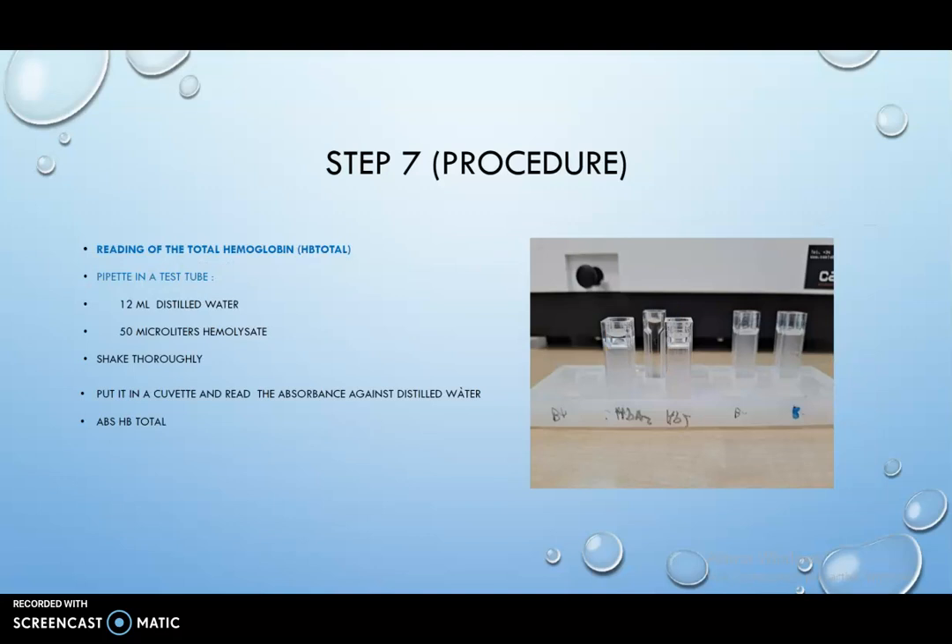Step 7: To read the total hemoglobin, pipette into a test tube 12 milliliters of distilled water and 50 microliters of hemolysate. Shake thoroughly. Put it in a cuvette and read the absorbance against distilled water to obtain the total hemoglobin absorbance.